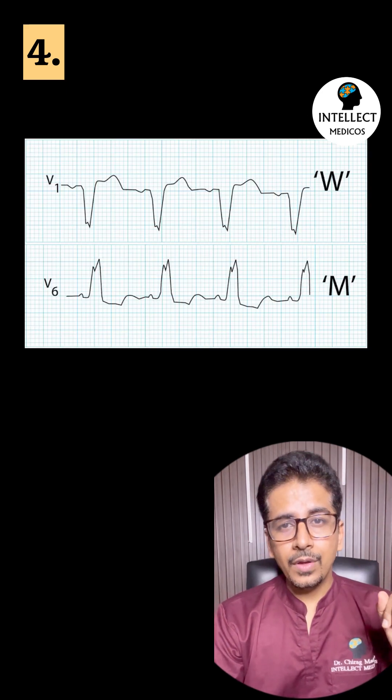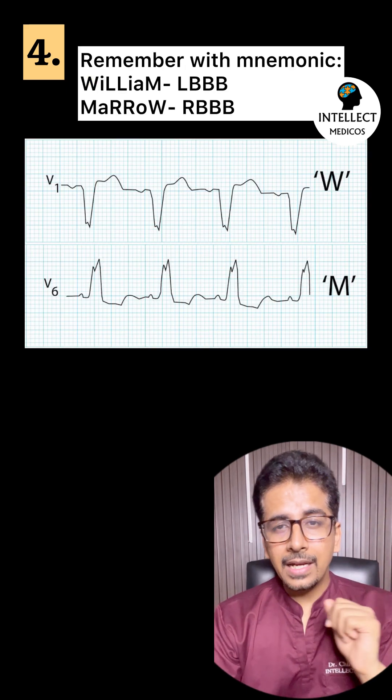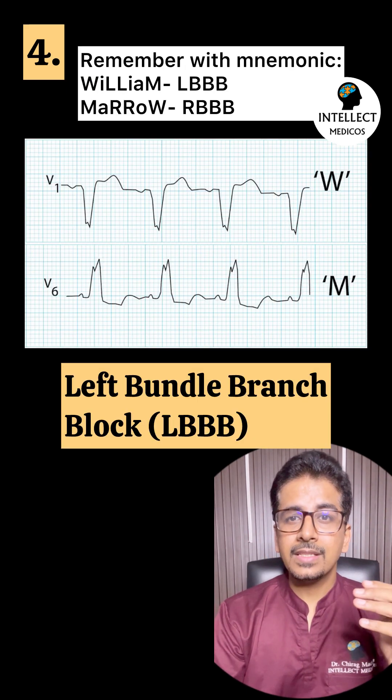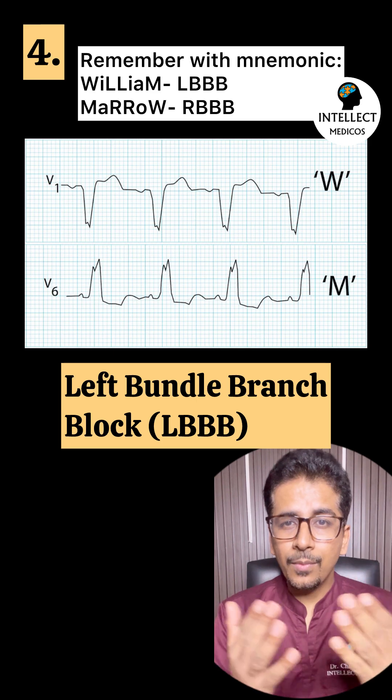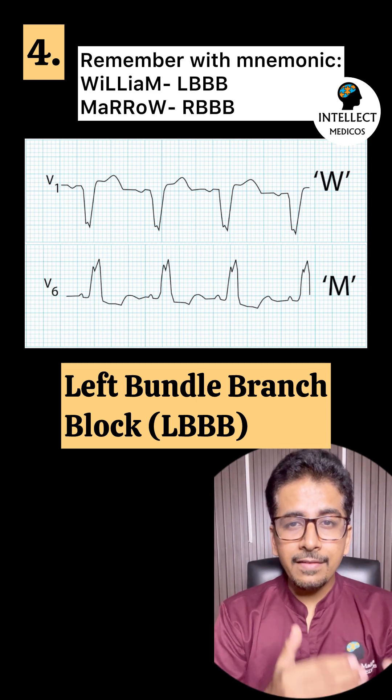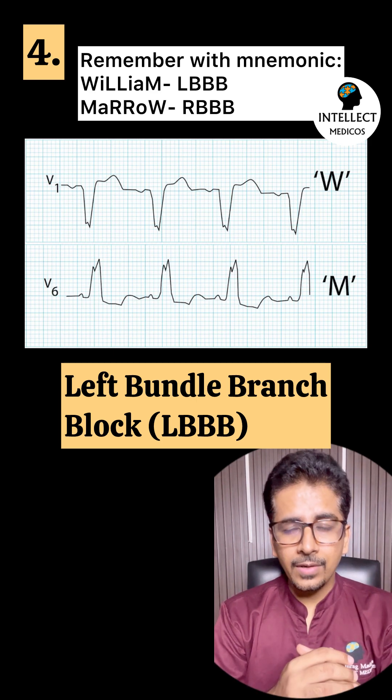Fourth: there is a W pattern in V1 and M pattern in V6. This is William, or you can say left bundle branch block.